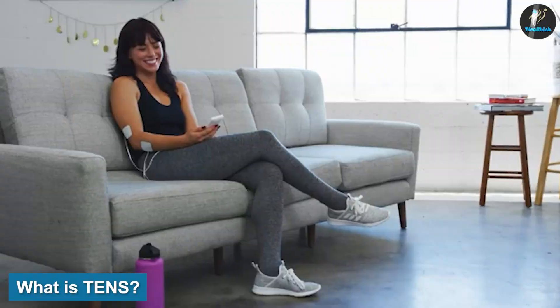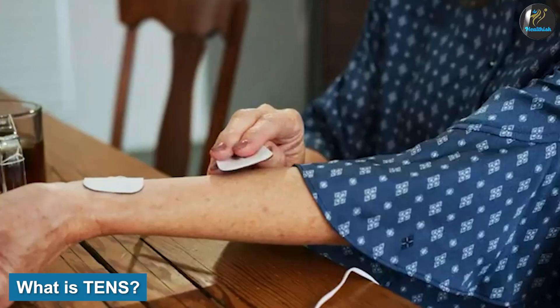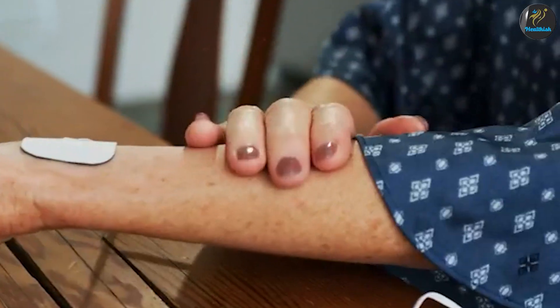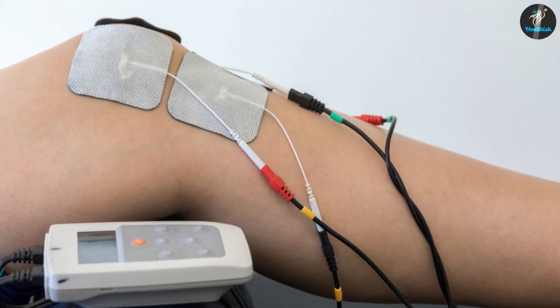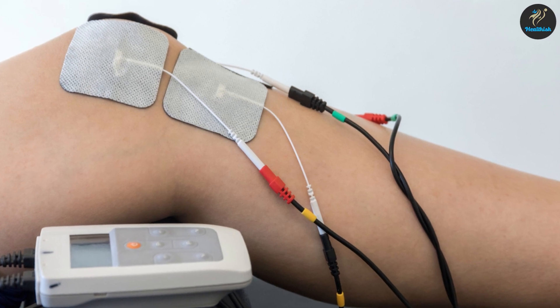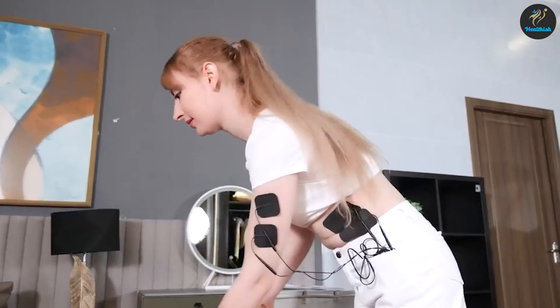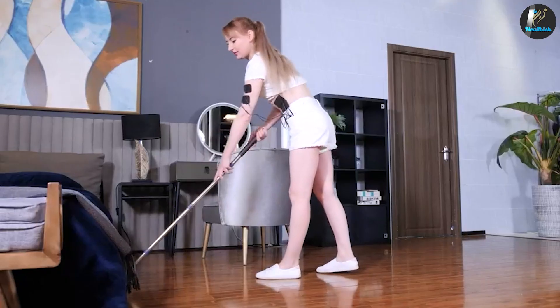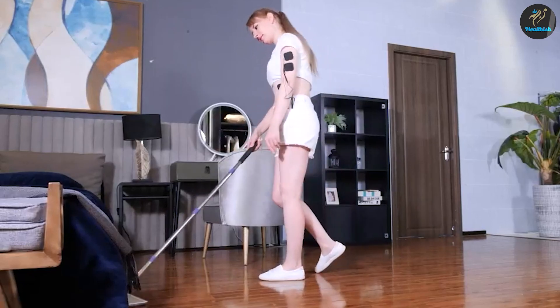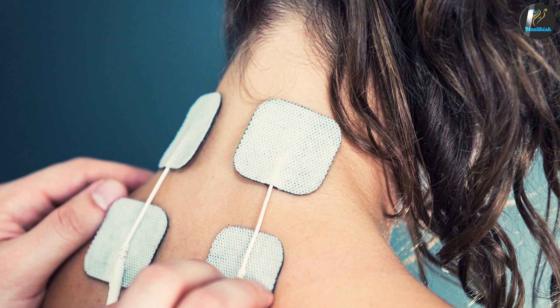What is TENS? Transcutaneous electrical nerve stimulation. TENS is a non-invasive pain relief technique. It requires using a small handheld or tabletop device, known as a TENS unit, which is connected via thin wires to adhesive pads. The adhesive pads, known as electrodes, are placed directly against your skin. When the unit is turned on, the electrodes transmit low-voltage electrical signals to your body. The frequency and intensity of these signals can be adjusted as necessary. These signals interfere with pain regulation.